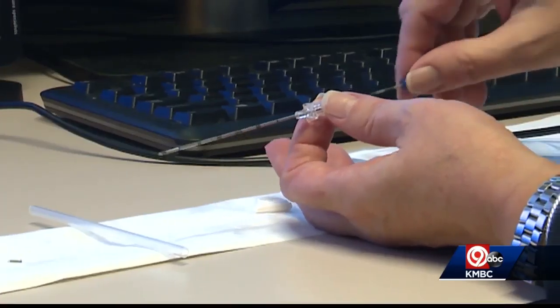The MagSeed is also easier on the patient than the previous method. It's simple to place, it's inside the breast, it's non-painful, whereas the wire would actually come out of the breast.